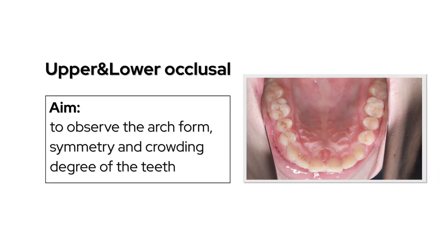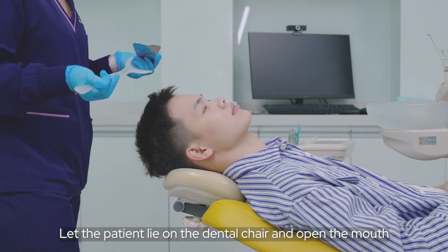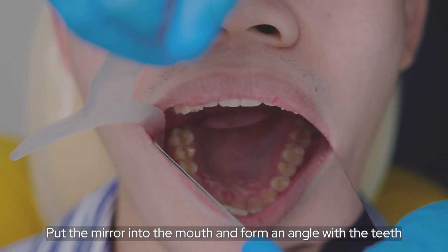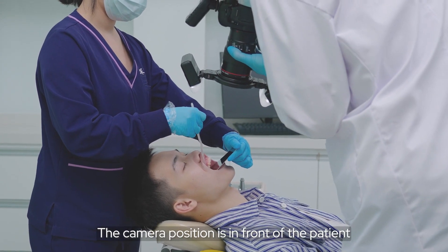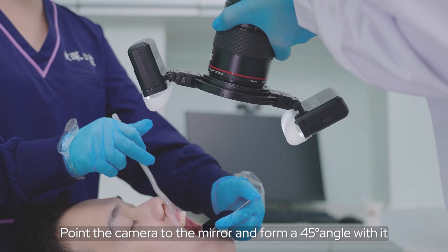For upper and lower occlusal views, observe the arch form, symmetry, and crowding degree of the teeth. Let the patient lie on the dental chair and open the mouth. Pull the lips off the teeth with the retractor. Put the mirror into the mouth and form an angle with the teeth. The camera position is in front of the patient, from the camera to the mirror at a 45-degree angle with it.